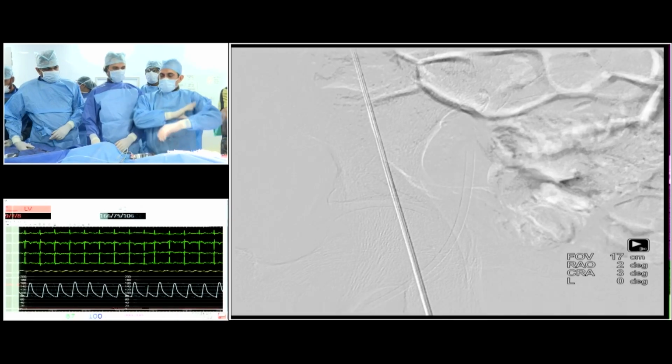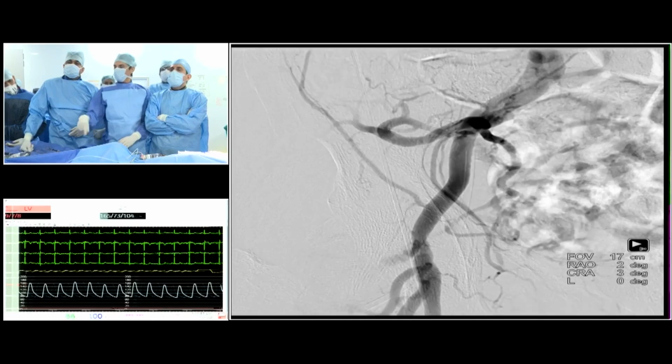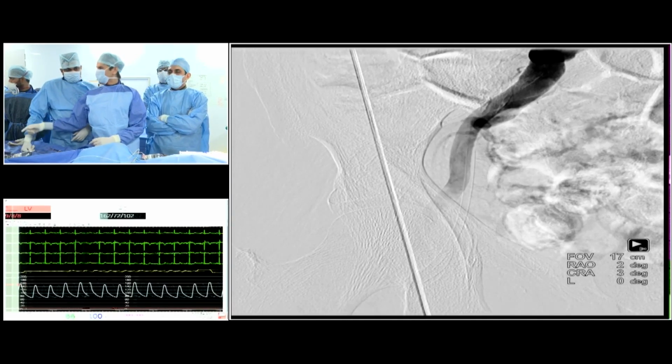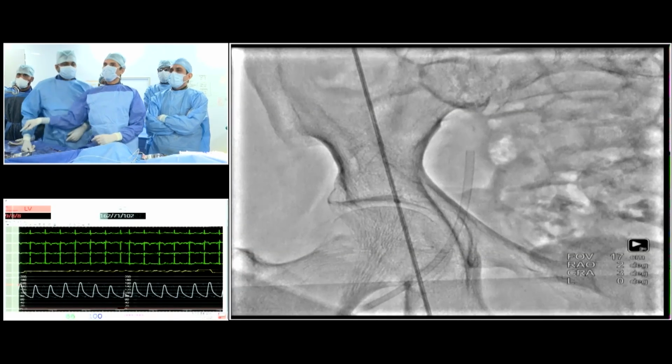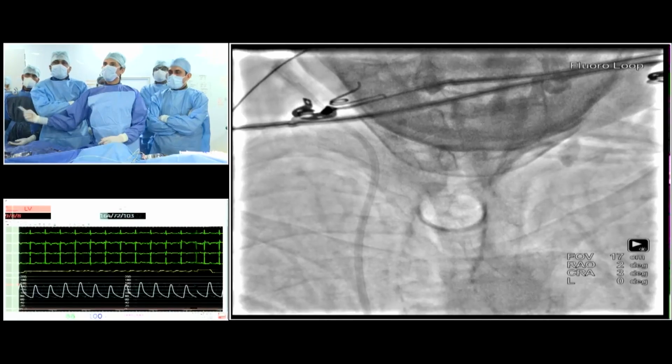So this is where we are now. Well, 4 more minutes to go. Congratulations, really expertly done demonstration. Yeah, superb work, good technology, and very impressive case.